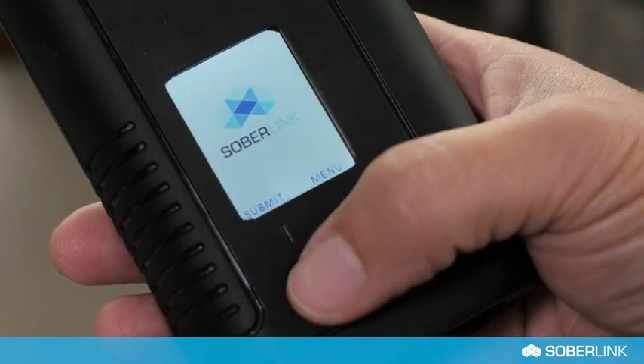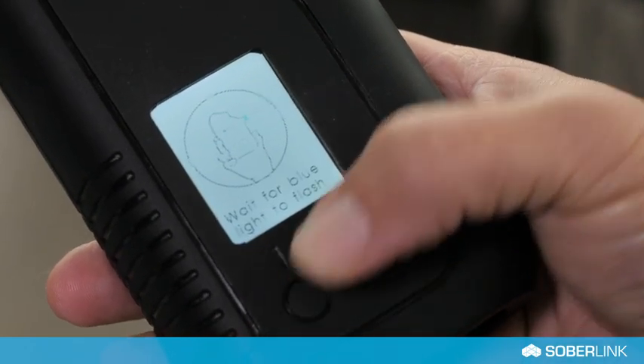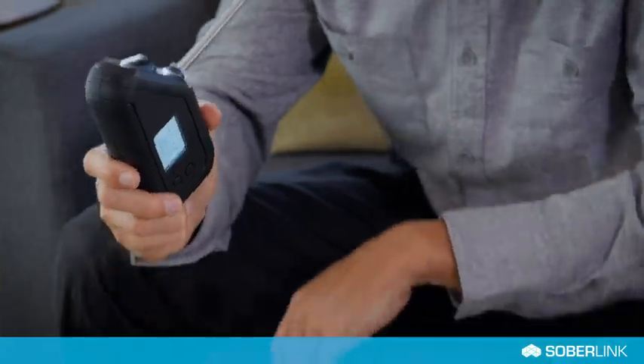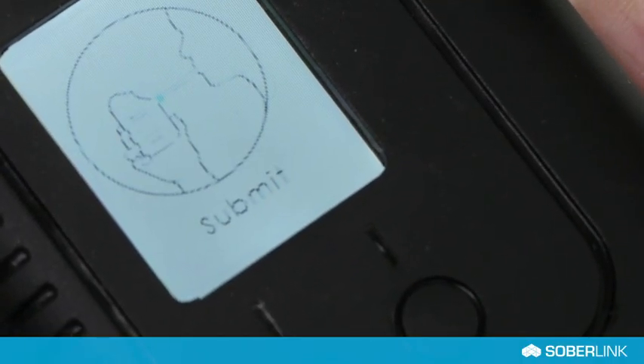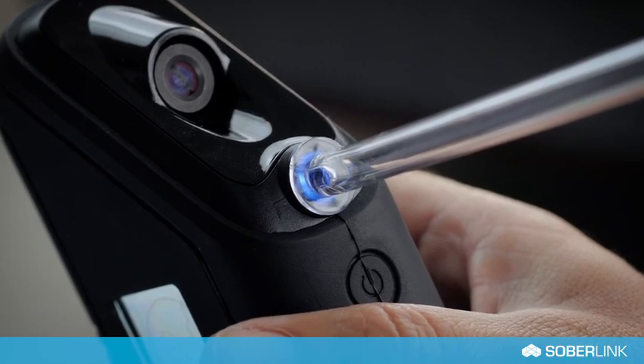Use the left display button on the device to select submit. Please note that the device screen is not a touch screen. Follow the prompts on the device screen and wait for the blue light to flash before submitting a test.